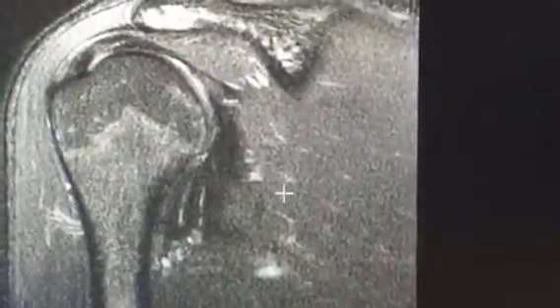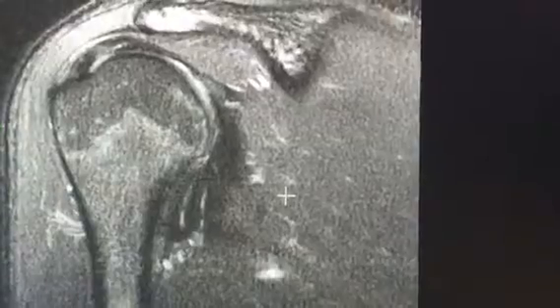So what you're looking at now is a T2 weighted imaging of a right shoulder in a coronal plane. And this U structure here, or this U fiber, is a normal inferior glenohumeral ligament. So I wanted to emphasize that just so you have an idea of what the inferior glenohumeral ligament looks like. And we'll review later important lesions in which we either have injury in this area here at the humeral attachment, or we have injuries at the glenoid attachment.